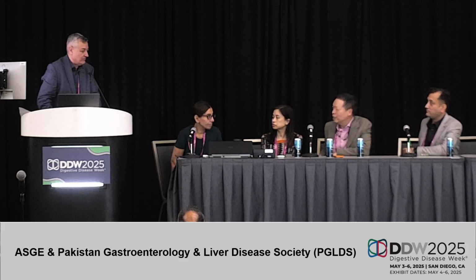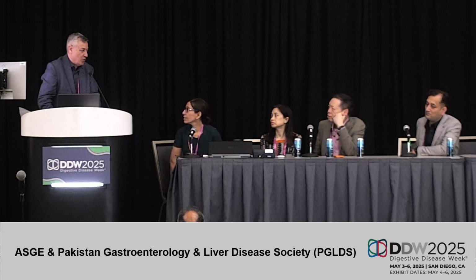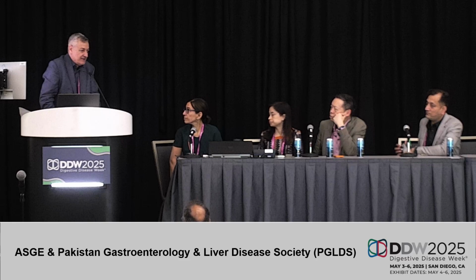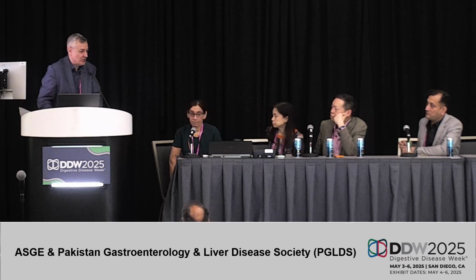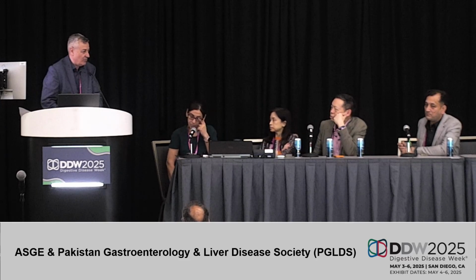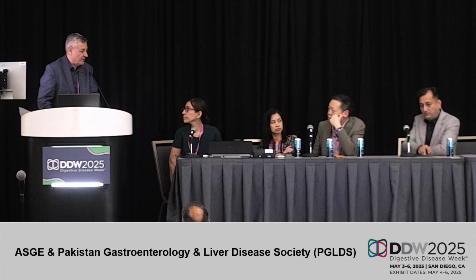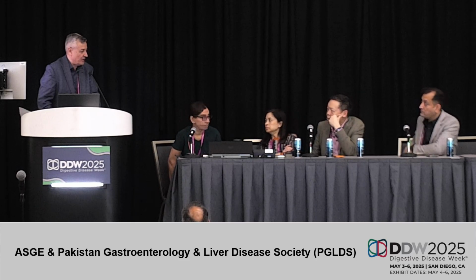We usually do FNB, just accepting that number. I think the seeding rate is really low. It's the same discussion in cholangiocarcinomas, in Klatskin tumors. There are centers which prefer to avoid FNB, but at least in our center, we have quite a large oncology department, so they always want the diagnosis before the multidisciplinary meeting and before deciding on surgery. So we still do puncture of tumors in the body and tail of the pancreas.